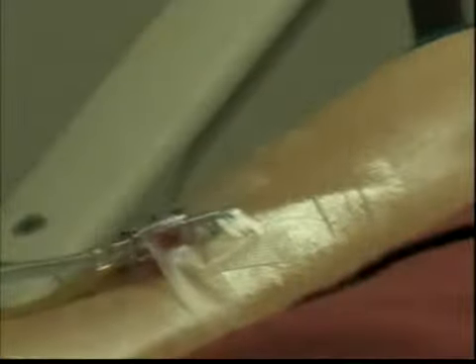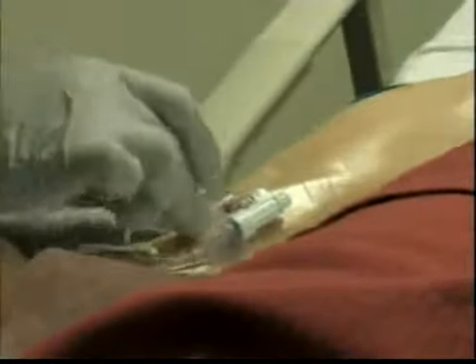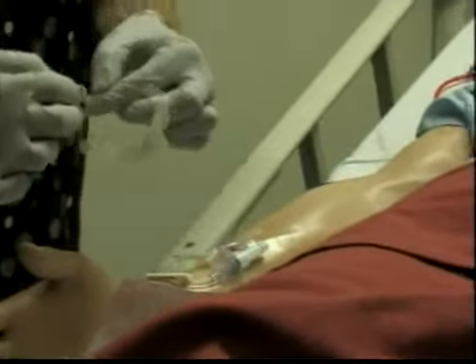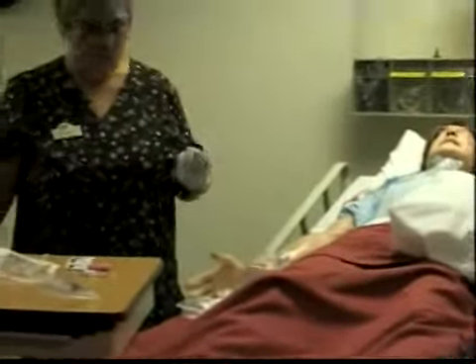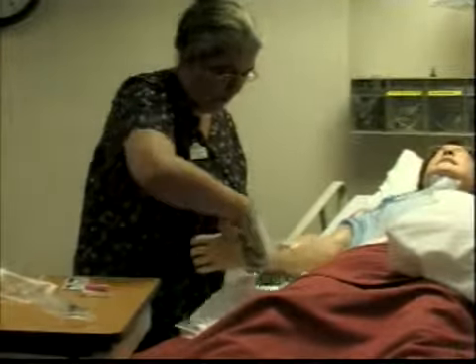This is one of many ways that you can tape the IV, and we'll discuss the rest of them in lab. Then you're going to get another longer piece, and you want to make sure that you loop your extension and that you tape it in place. Remember that you have this part in here where you will put your date, time, and initials, and you're going to put it in a place where it's away from the site, away from the site. You want to make sure that you take this to the sharps container, and that you have cleaned every area, all the things that you have in here.